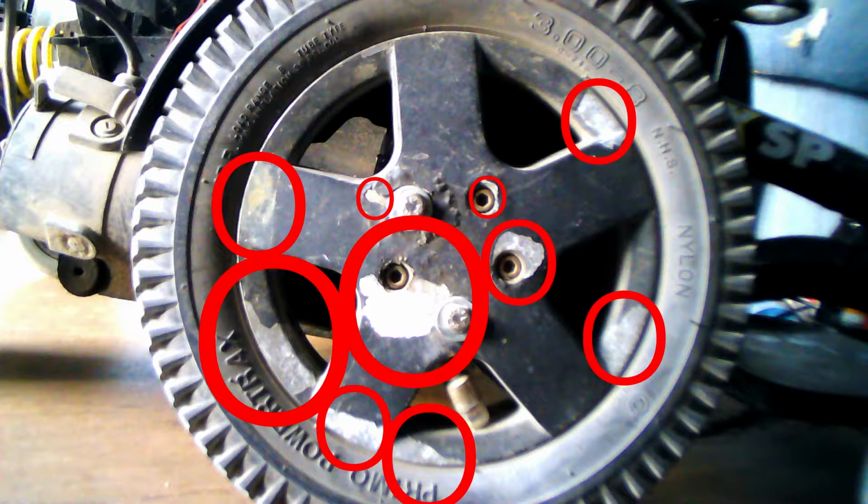The manufacturing paint lasted for around 3 years on the hubcaps. It initially started chipping when the tire was being removed to replace punctured inner tubes. Around year 4 is when it started flaking off when being rubbed.